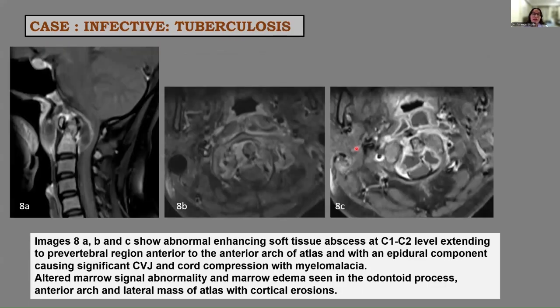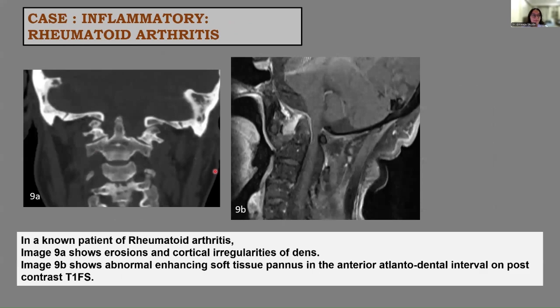Next, a patient with neck pain for one year. Images 8A, 8B, and 8C show abnormal enhancing soft tissue abscesses at the level of C1 and C2, extending into the pre-vertebral region anterior to the anterior arch of atlas, with an epidural component causing significant compression at the CVJ and cord compression with myelomalacia. There was also altered marrow signal with marrow edema in the odontoid process, anterior arch of C1, and lateral mass of C1. The abscess was tubercular in origin.